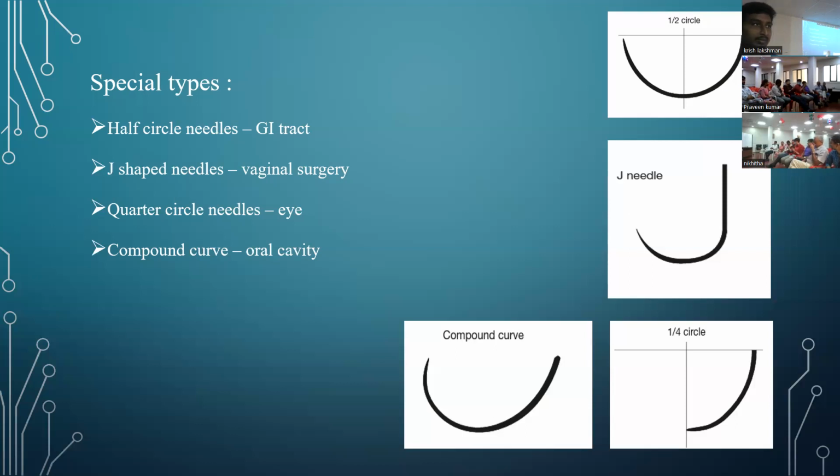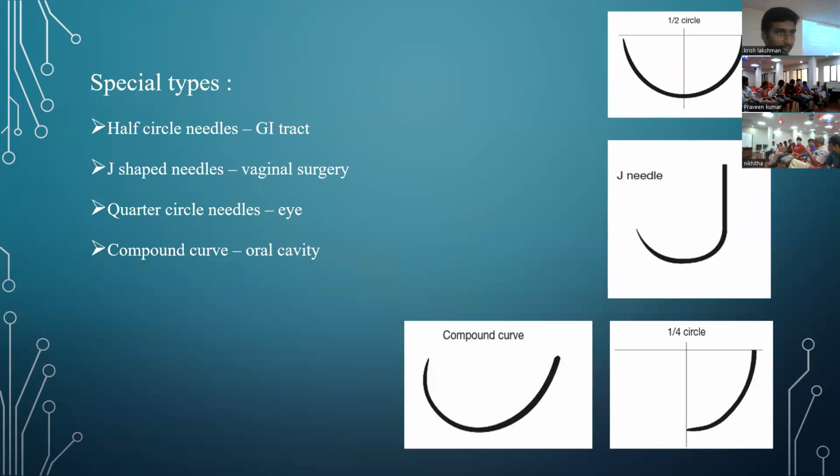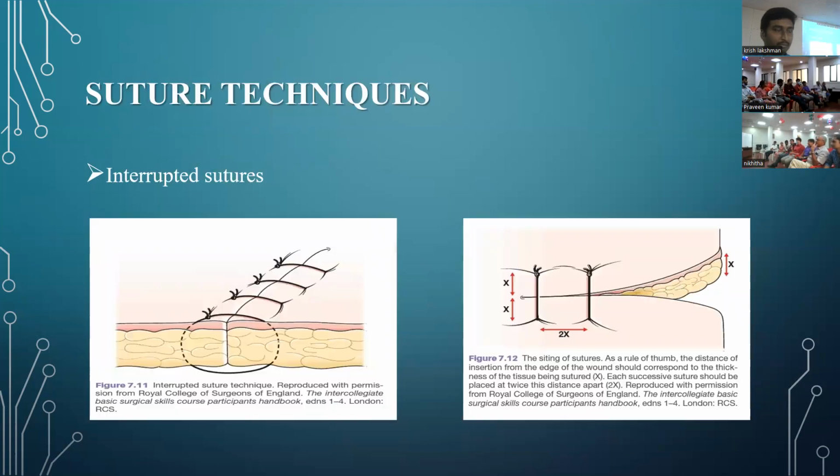Earlier we used straight needles with an eye, we don't use that now. Because of the needle, you're now using port closure, which is even better. Under vision, you're confident that you've gone through all the layers, as against just blindly taking it from the surface.